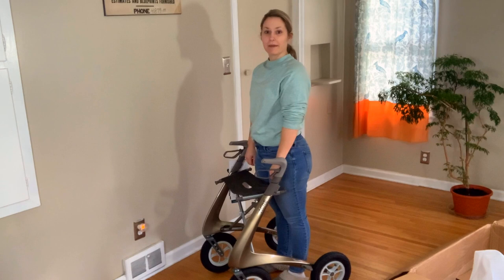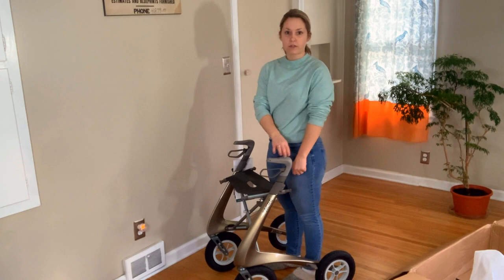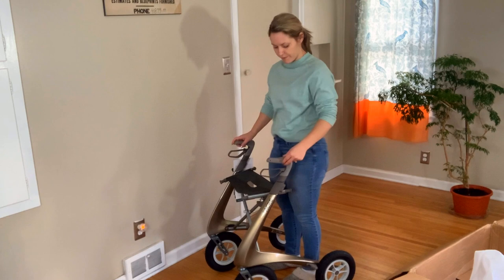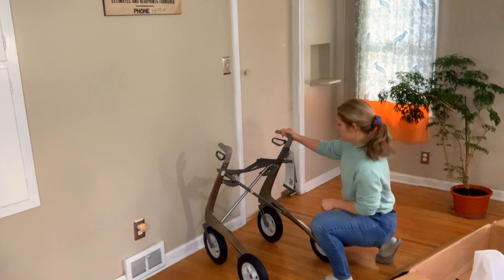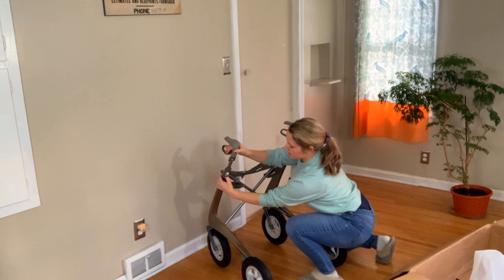It actually came at a perfect height for me. I'm 5'2". You want to make sure that you measure your rollator — standing up tall, arms down by your side — and your wrist bones should be in the same alignment as the top of the handle. So this is perfect for me at 5'2". But I do see you can change how high you need them to go just by pushing in here and lifting up, same thing on the other side. You can change it to whatever you need. It's super easy to do.